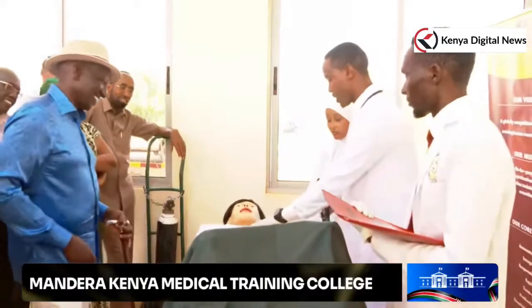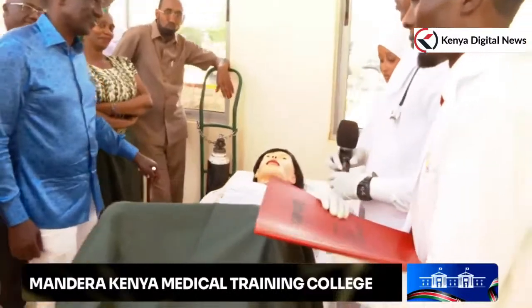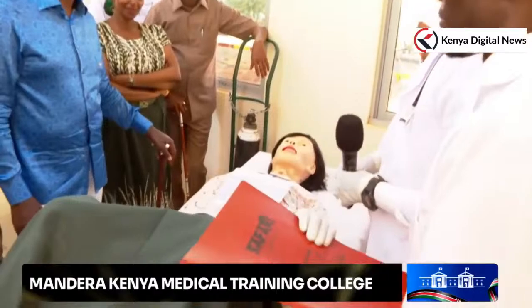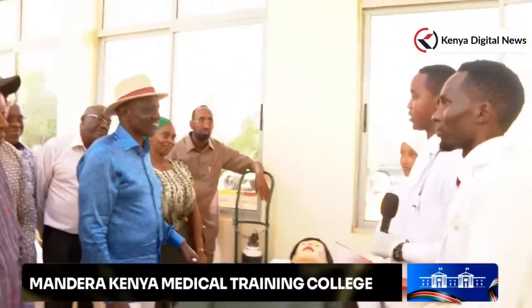Correct. So this one is a urine bag. We will accumulate the amount of fluid that will come from the bladder, and we have the ranges here. It will help us in knowing how much fluid we got from this patient. And that is how the procedure is, Your Excellency.